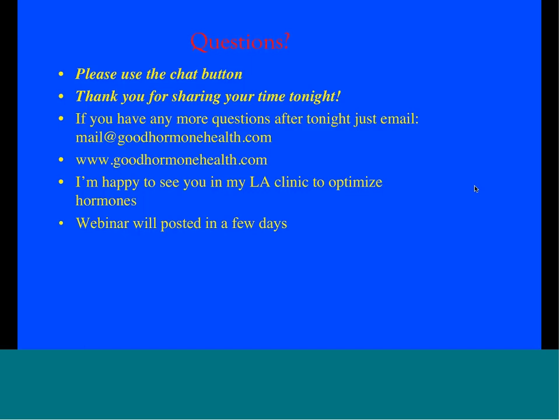Bethany asked, do you feel there's much disparity between the testing on the app and the actual results? No, I think as long as you do it right, it's very accurate. And that's what the owner of the company says, the correlations between the lab test and what's on this device are very good, a high correlation. Somebody asks if this might be useful for diabetes insipidus? Right now, this is used for cortisol. And for diabetes insipidus, you might want to get a sodium level, for example. And I think some things like that are going to come.